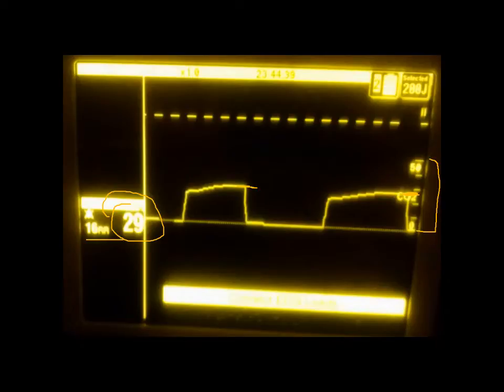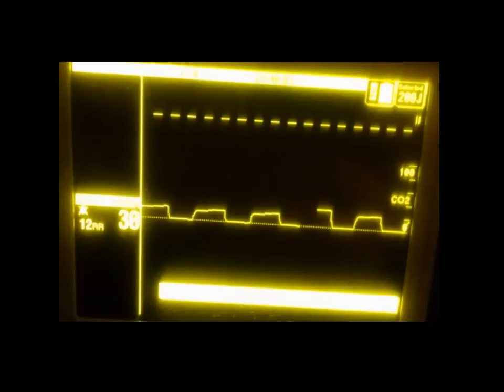But what would happen if you change this scale? Instead of 0 to 50, now we want to change it to 0 to 100. The result is smaller boxes. So essentially the same thing. This one's 30 instead of 29, but essentially the same thing, which is running right here. So this is from 0 to 100.